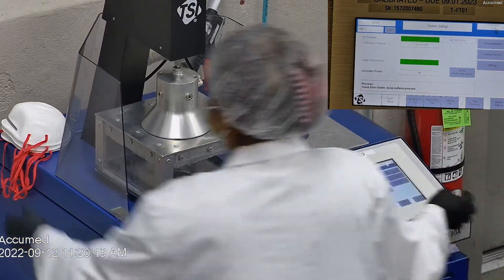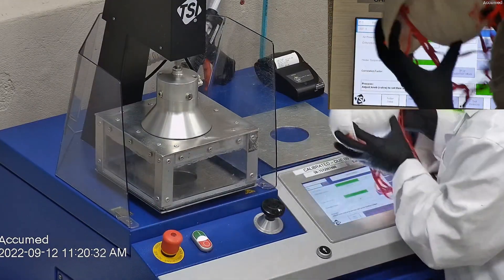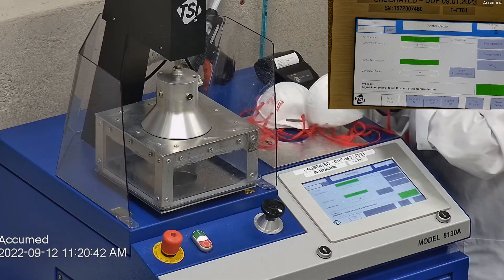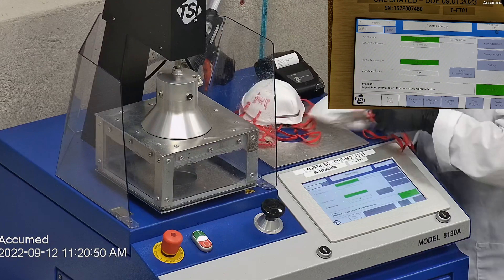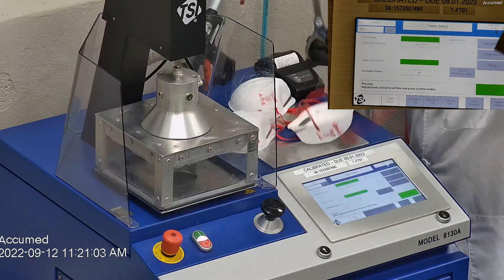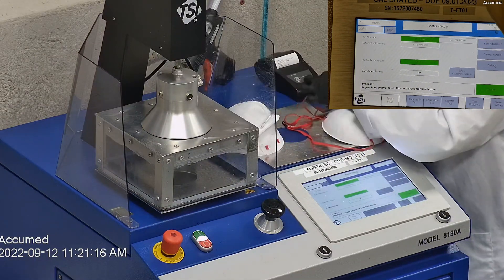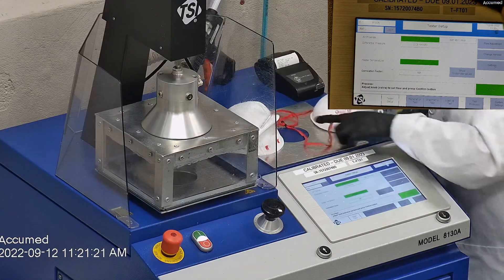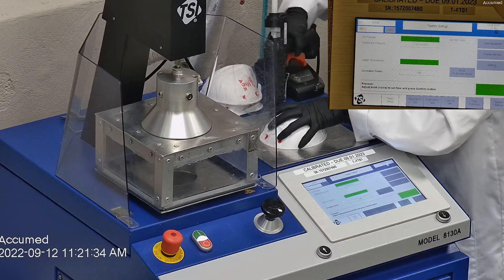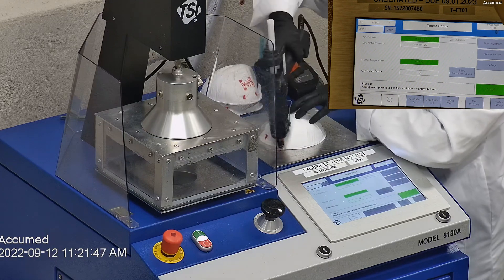This is our TSI machine model 8130A, which is also the same filtration testing machine that NIOSH uses to approve N95 respirators. Our procedure is also inspired by NIOSH. We first run a tester setup and start removing the headband from the respirator before placing it onto the testing plate to ensure a proper seal. Then we make sure that the mask is properly and completely sealed with glue to the testing plate. When applying the hot melt glue we make sure that there are no holes or leakage around the seal to ensure accurate results.